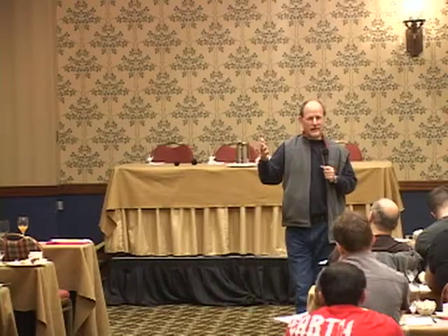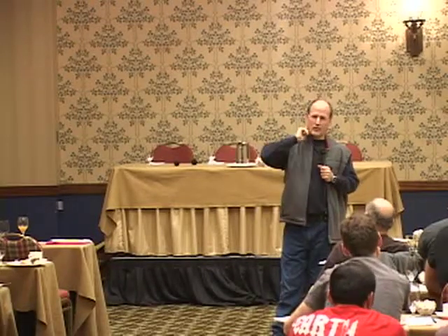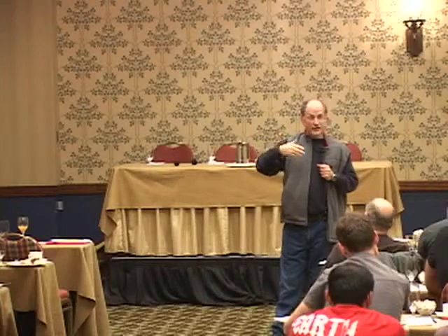Now you have the intermediate results where somebody's anywhere between 30 to 70%. This is where you need to sit down and decide with your cardiology group, how do you want to deal with these patients? They have real disease. It's not advanced enough that would cause stenotic type symptoms of stable angina or of exertional angina, but they do need aggressive medical management to prevent that from continuing. So you've helped that patient as well. You may also find dissection or pneumonia or whatever else. You're not going to find PE with this.